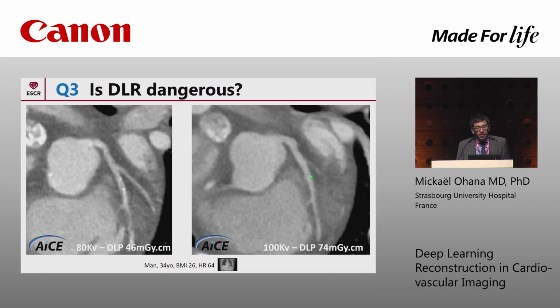and of course the LAD is normal here. So what happened here? We think that the dose was probably too low for this patient, and some artifact appeared, and on ACE DLR, the background noise is removed, which means that some artifacts can stay and be more prominent. So I wouldn't call that a creation of a false image, but it's more like an artifact of the algorithm.